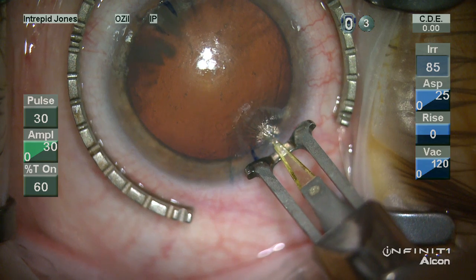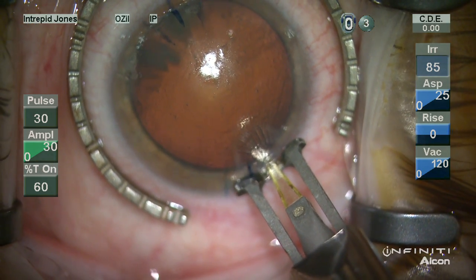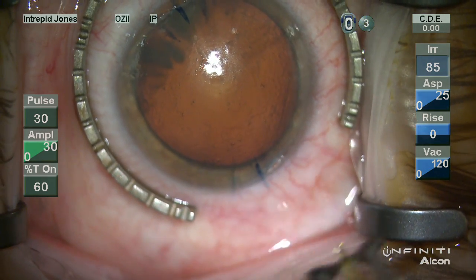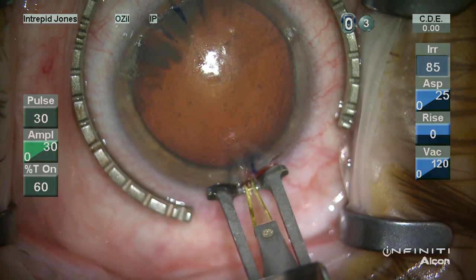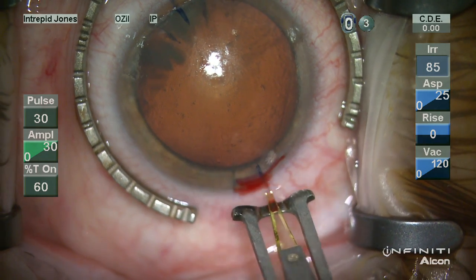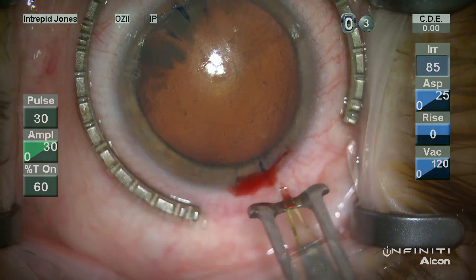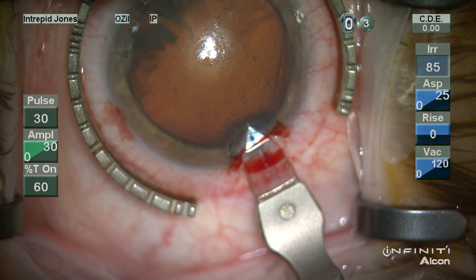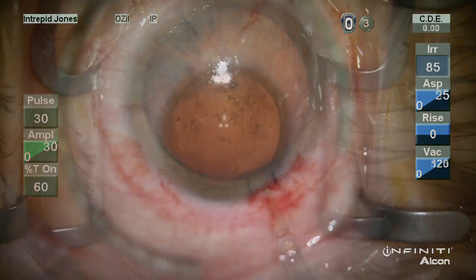For the main wound, the incision is made in essentially the same manner, however it is slightly more peripheral. You can see here we're going to get some heme that fills this channel and helps to delineate where we've incised. The posterior edge of the wound is depressed and the main wound is made centrally in this LRI.